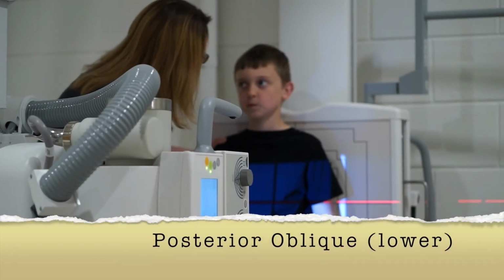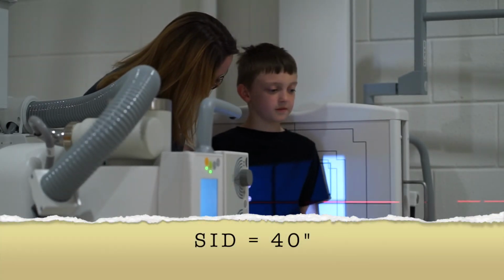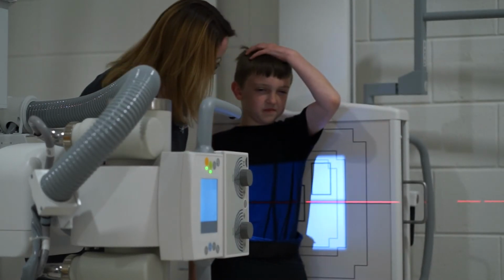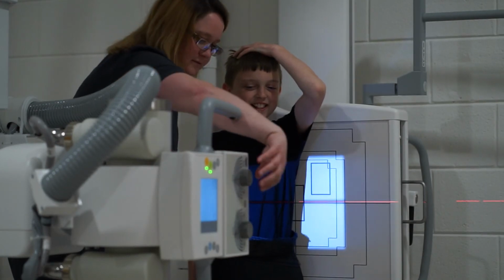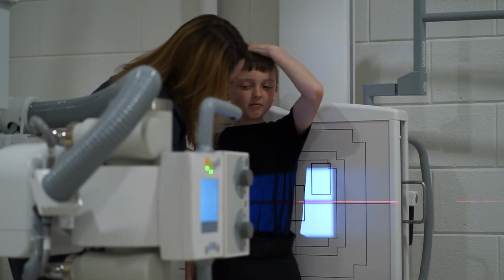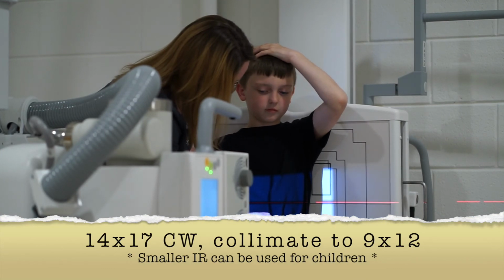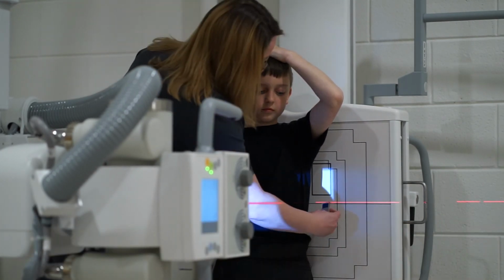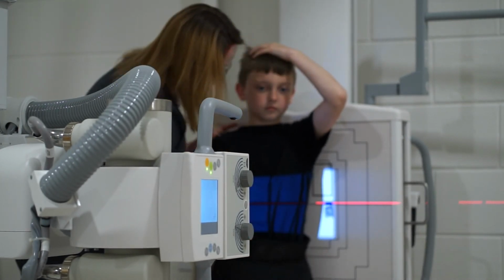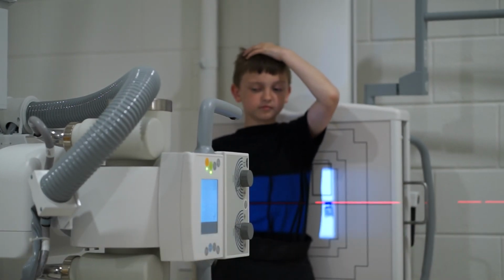All right, one more and your last one, okay? Okay. So you're going to turn again. Oop, that was too much. And put your hand on your head. Don't hurt yourself doing it. Right there. Okay, I want you to take in that deep breath, blow it all out, and hold it out.